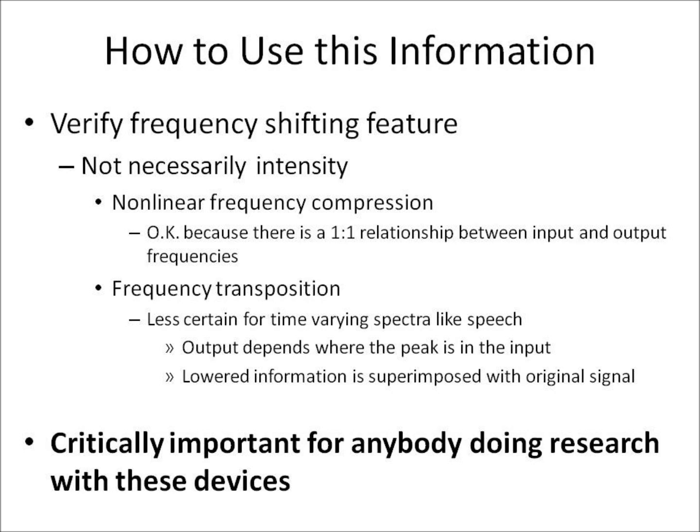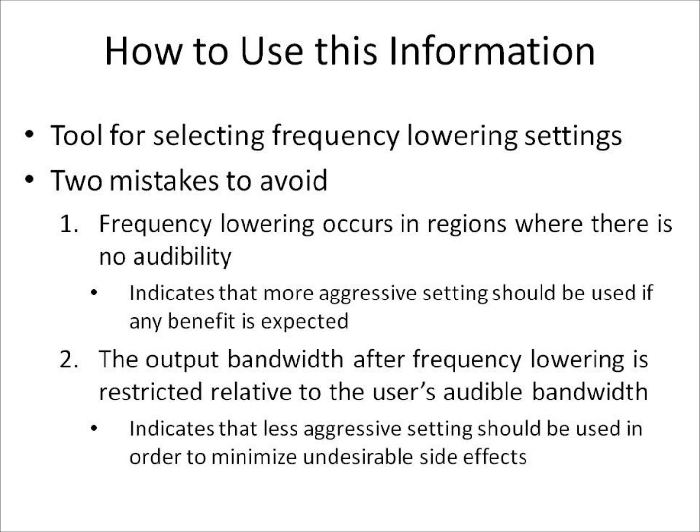Also, for those of you doing research with these devices, hopefully you will appreciate how useful this information can be. Having a recorded file on hand for each subject can be useful when going back through the data and trying to explain useful trends and any unusual behavior in terms of perception and/or production. Back to the use of this information in the clinic.